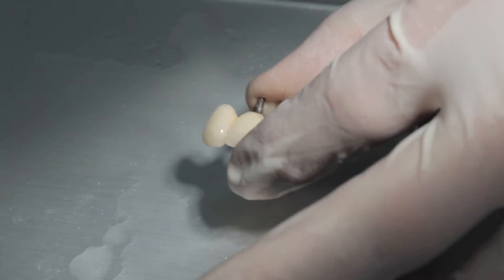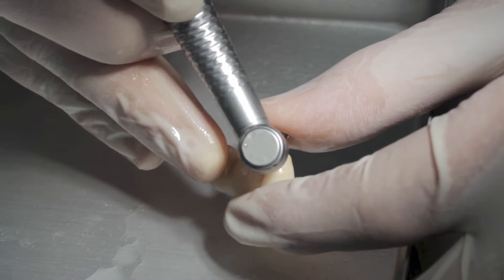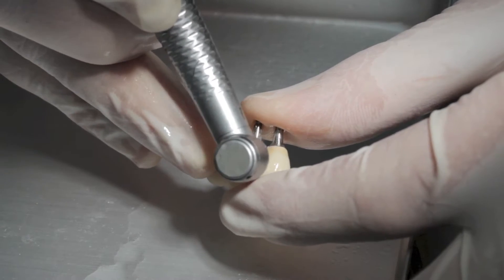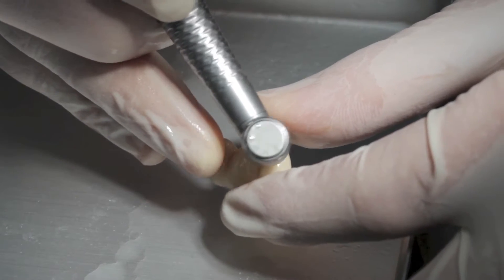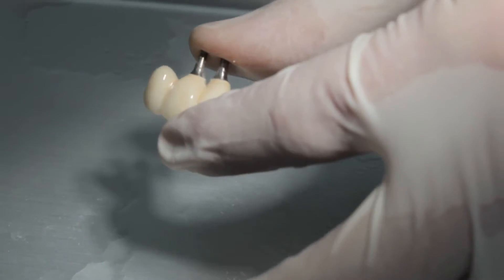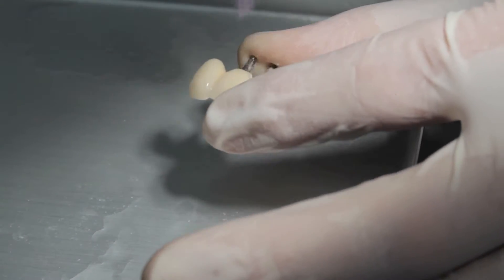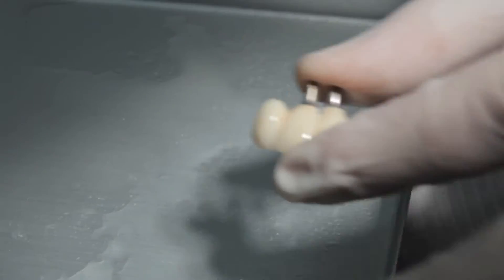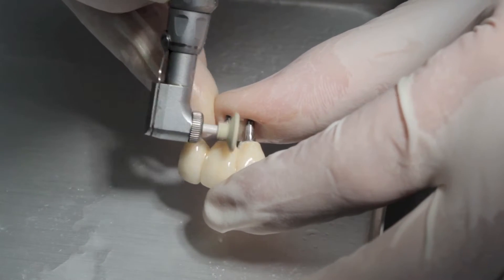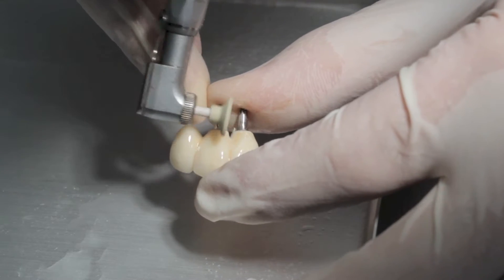We just want sufficient space to allow the teepee brush to pass without becoming too much of a struggle, so I'll just open this up a little bit more and have that polished up.